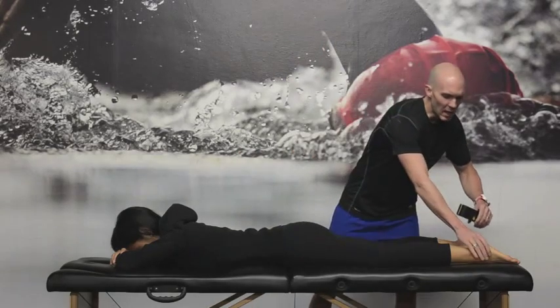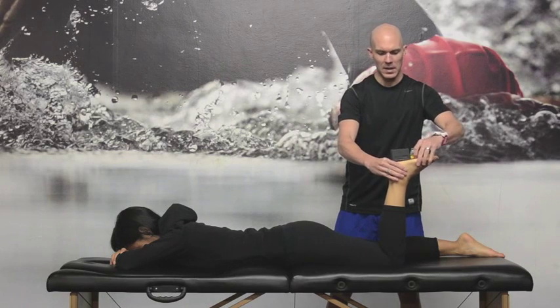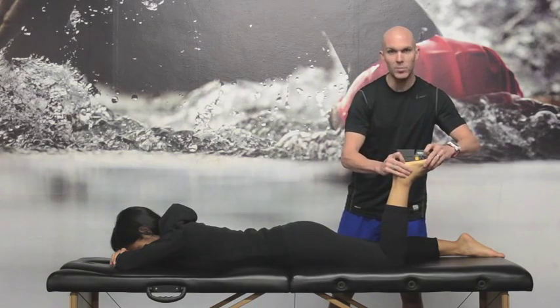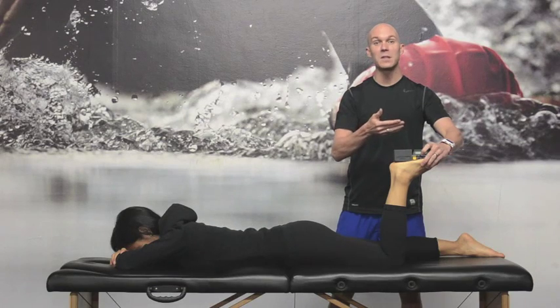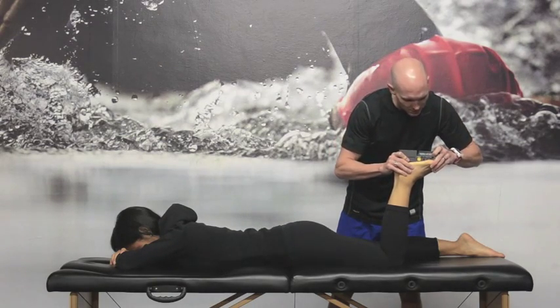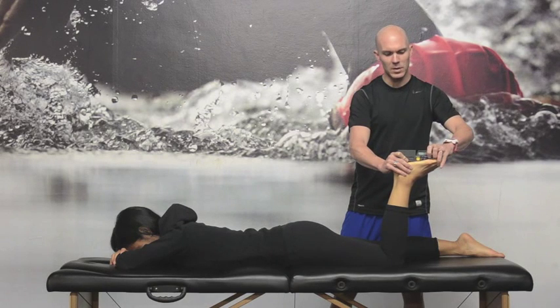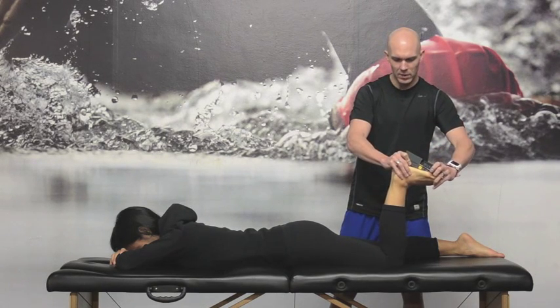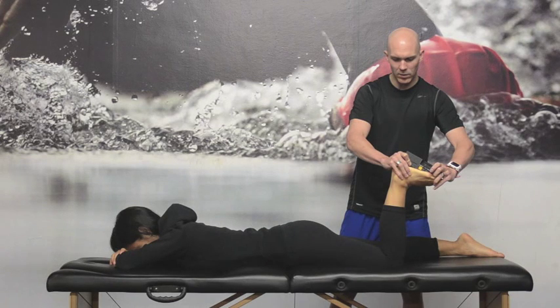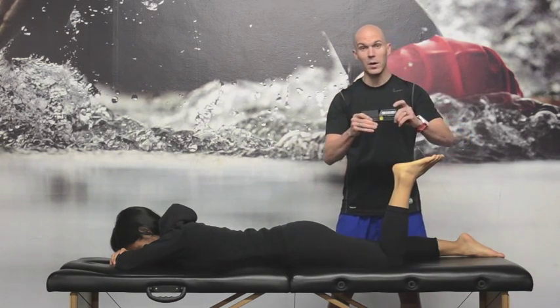What I'll do is passively flex the patient's knee to 90 degrees and take this to what appears to be level. You can notice the inclinometer is faced away from me so it doesn't bias my measurement when I go to repeat it. It's roughly at about zero. Maintaining this position, I'm going to dorsiflex the ankle and take it to the end feel — that was 30 on the dot.